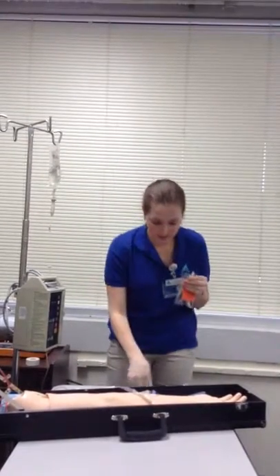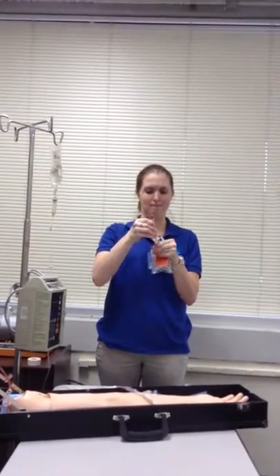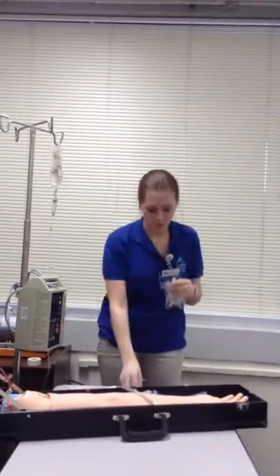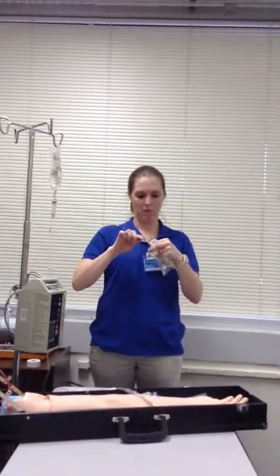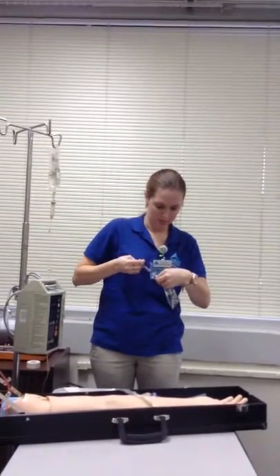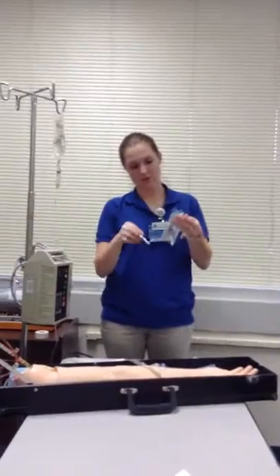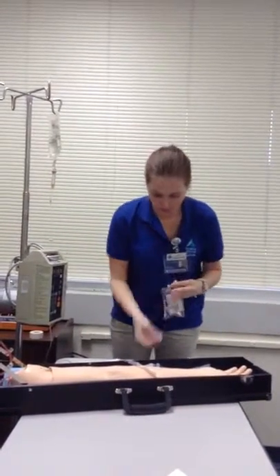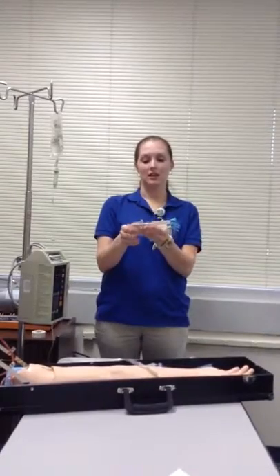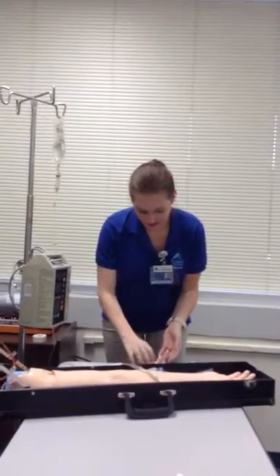So I would now clean this, take my medication. I need to re-clean it. Oh, there we go, finally. And push my medication in there. Then this would go into the sharps container. Okay. And then I would gently mix my medications.